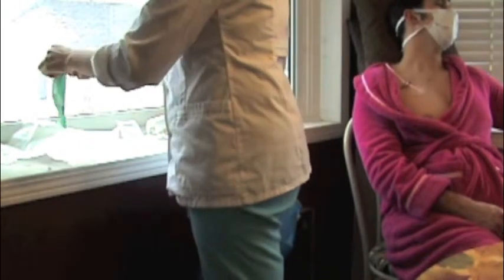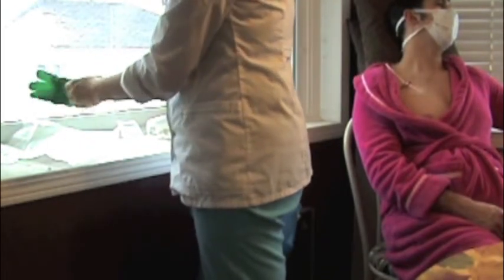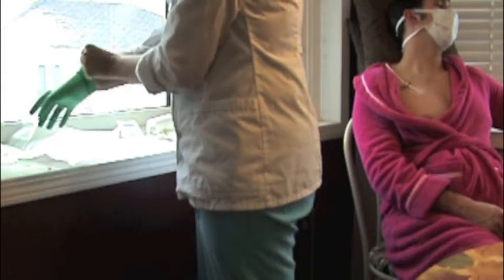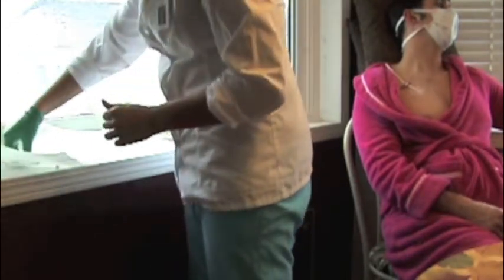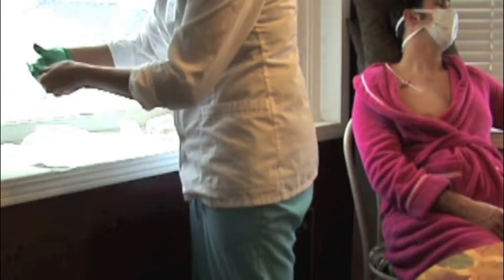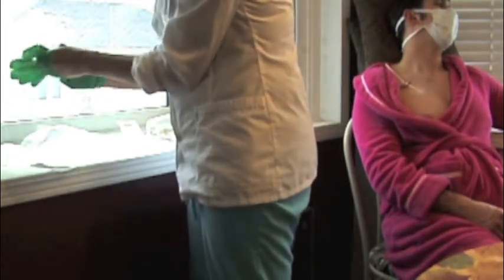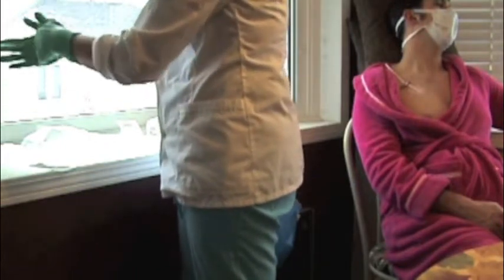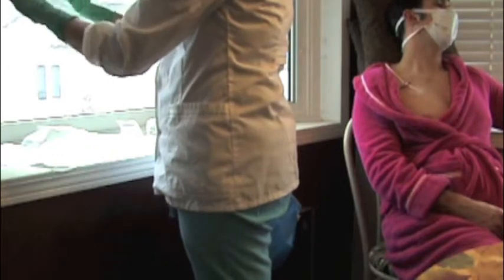And I'm going to don my sterile gloves. I'm going to wait for my hands to dry here so that it's not so difficult to put on. Make sure that alcohol's really rubbed in. Okay. Grab here. Of course, they never go on easy. I think my hands grew. Okay. Keep my thumbs up, inside where it's still clean. Okay.